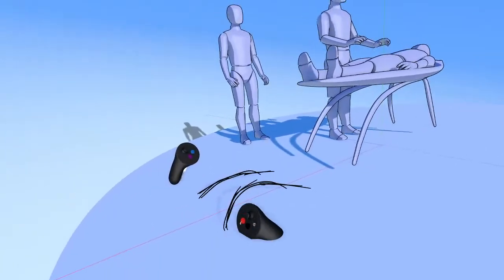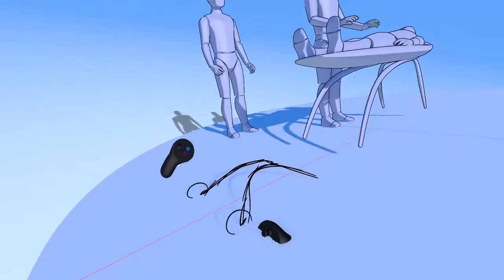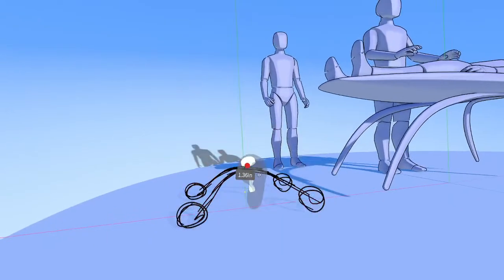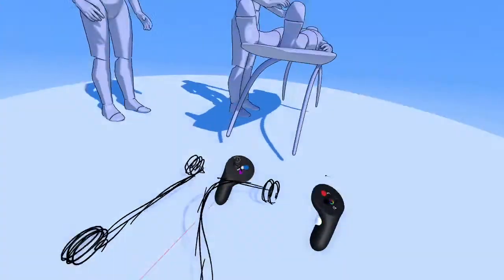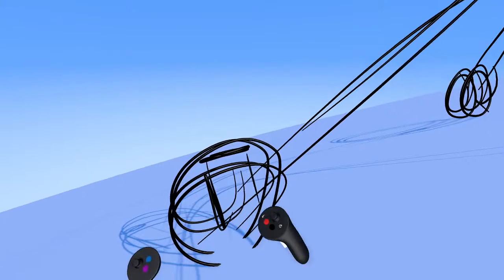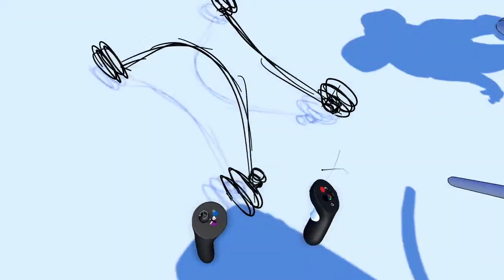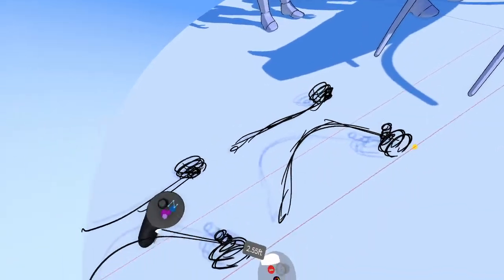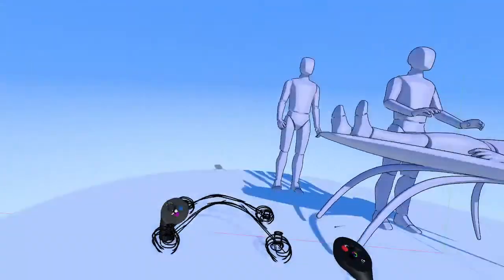First, let's start with a wheelbase, but maybe not something that sticks out too far. We'll make proper wheels in a bit, but for right now, again, we are sketching out the idea, so all we need is indication. Maybe it has a pivot point right here that drops down for the wheel, like that. Kind of like that. And by the way, if you have an opportunity to duplicate geometry instead of creating new stuff, do it. Use the smart move, duplicate it over. Now we have two wheels, easy, and we didn't need to build it.